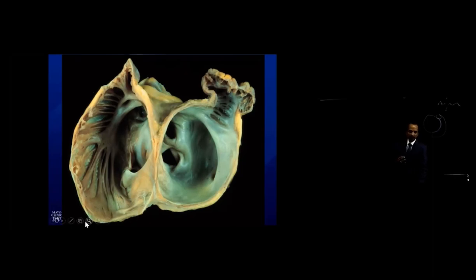And that's why if the cavotricuspid isthmus hasn't been ablated, you might entrain it from the cavotricuspid isthmus. But ablating there alone will take this limb out of the circuit, but you could still usually, not always, use the septal myocardium to finish the circuit.